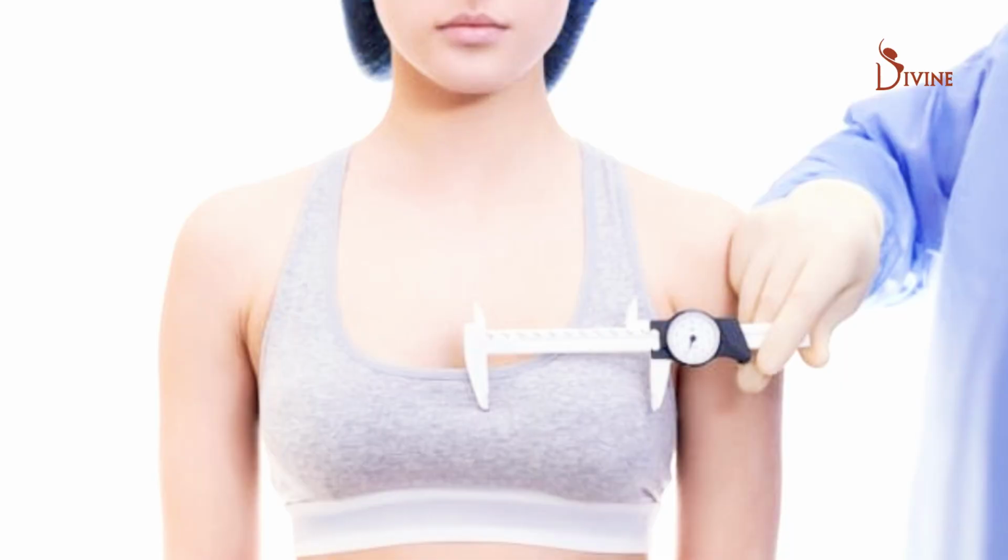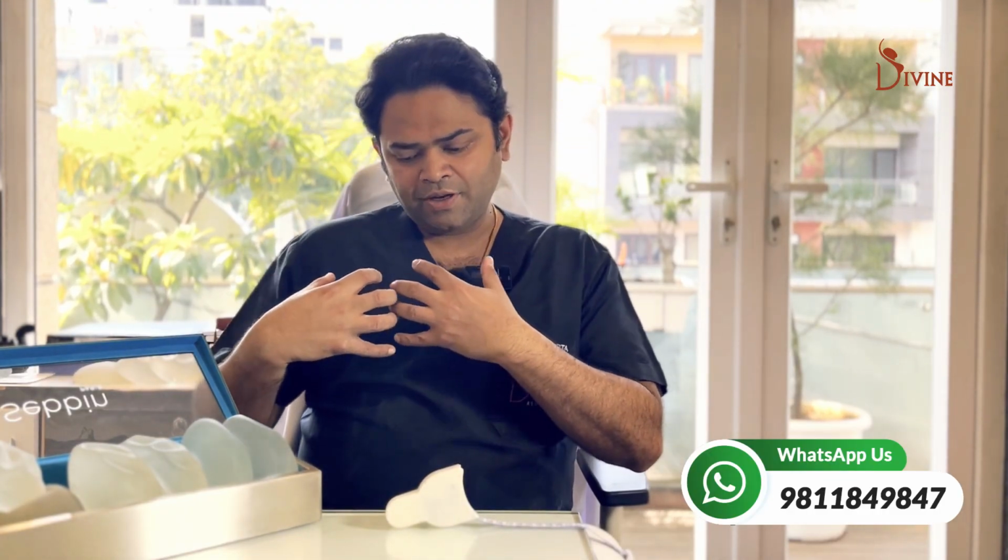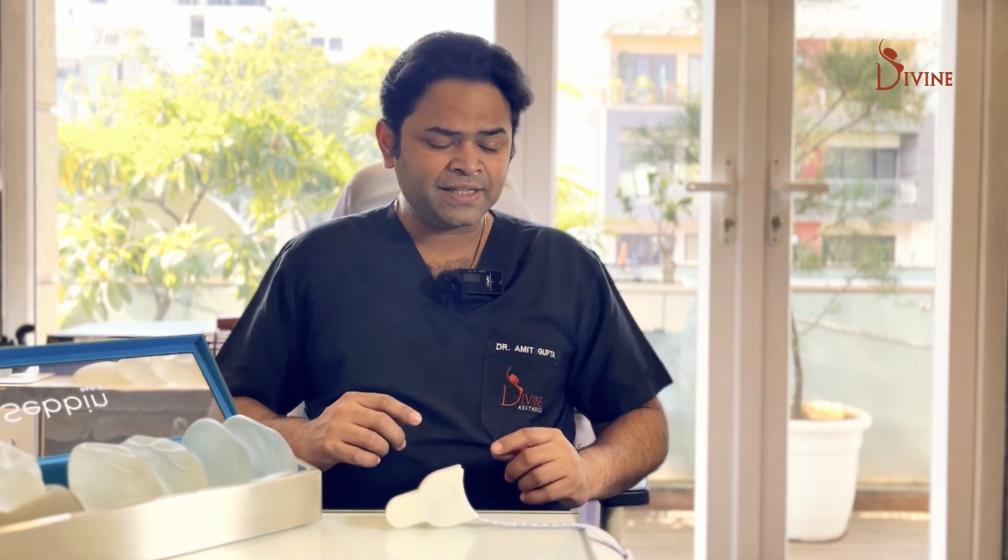The first thing that we do is measure your base diameter of the chest. We take an assessment of the base diameter, and make an assessment of the looseness of skin, how lax the skin is, and if we pull the skin, how high it will go. If it's a very firm skin, then we can't use a large implant. If the skin is a little lax, then we can use a large implant. So I'll give you an example of this.